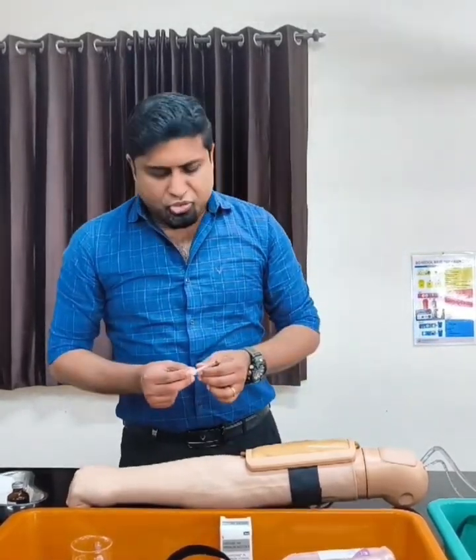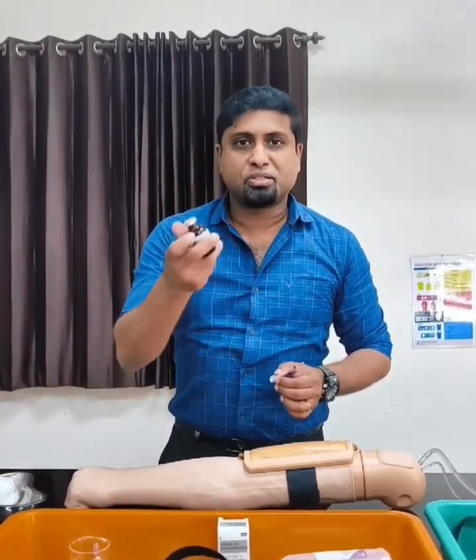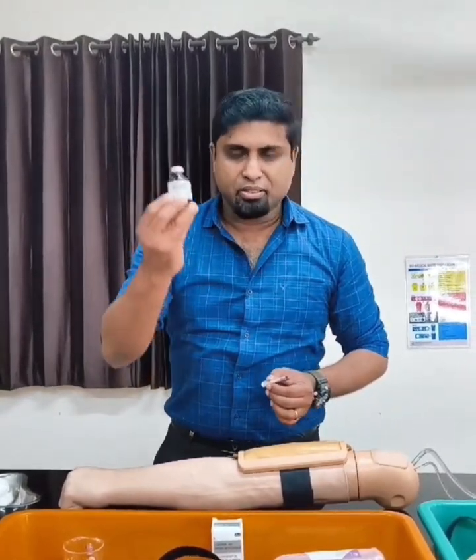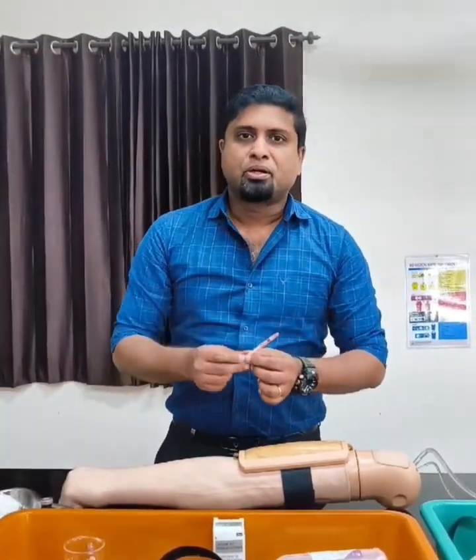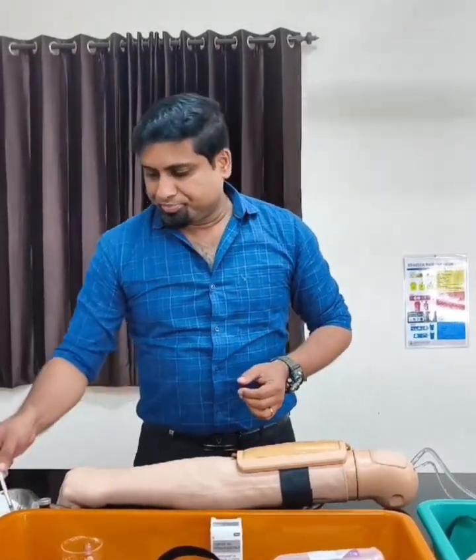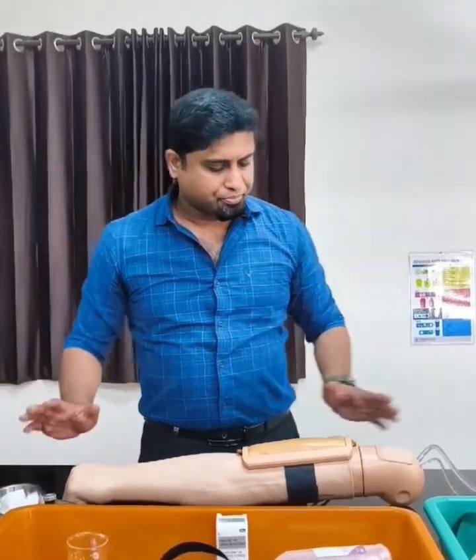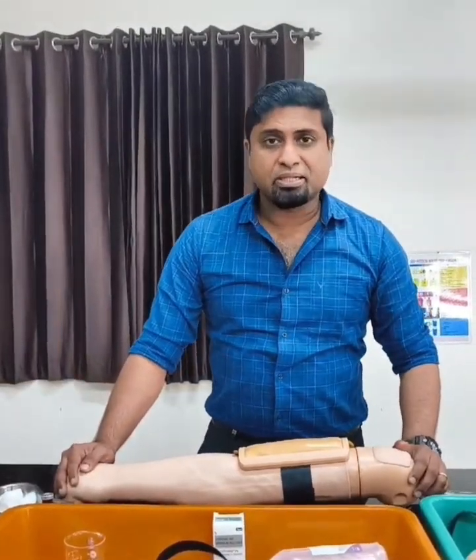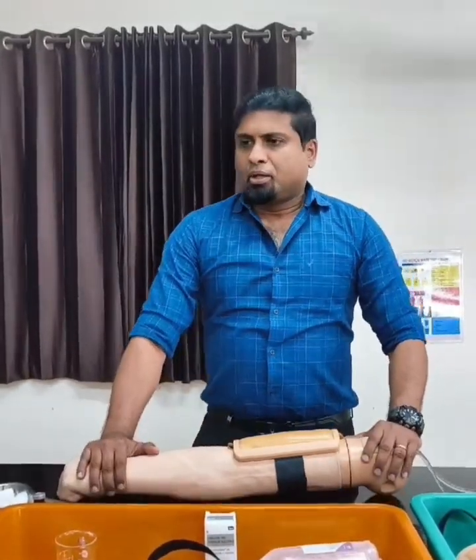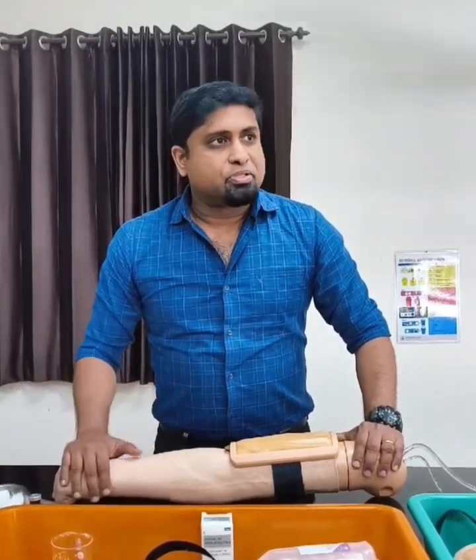So once we know about that, we take the vial of insulin. Obviously, this is not a vial for insulin, but for the sake of the discussion, let's pretend that this is one vial of insulin containing U40 strength of insulin, and this is an insulin syringe. We have some cotton, an antiseptic solution, and this is our part task training, where we shall demonstrate the administration of insulin. Now, obviously, insulin is administered subcutaneously for most purposes.